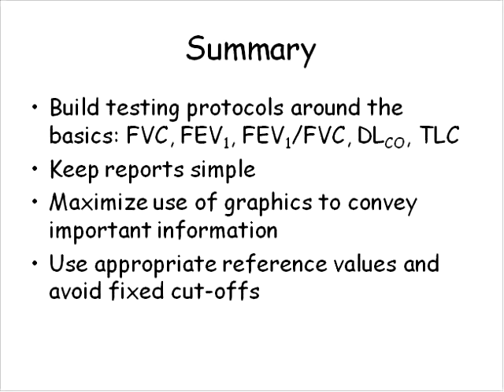We want to make sure that when they blow out as hard and as fast as possible, and we measure the FEV1 from that maneuver, they started that maneuver with their lungs full. So it's very useful if you can monitor the inspired volume. And most of the laboratory type spirometers that I use allow you to do that.